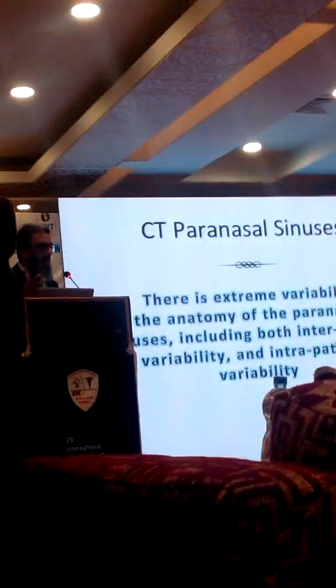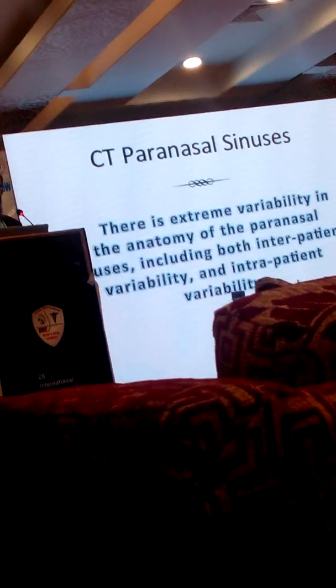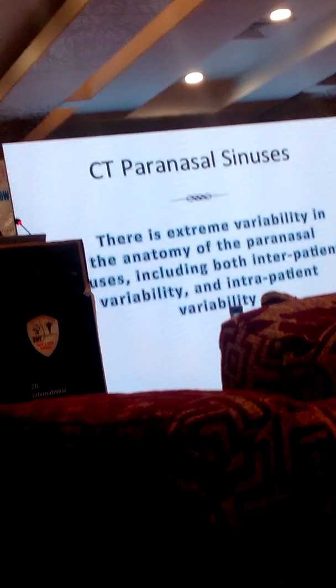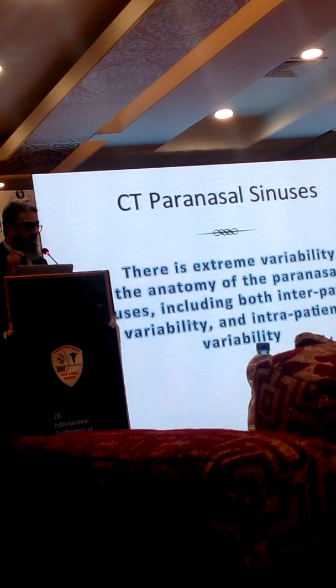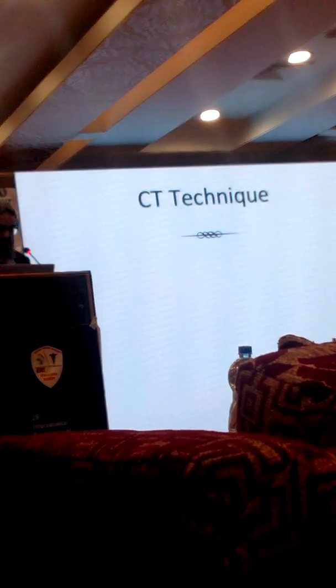One thing we should note is that we are human beings, and in endoscopic sinus surgery we are operating on paired sinuses. No two sides of a single individual have the same anatomy, what to talk of different individuals. Every individual has a different anatomy, every sinus has a different anatomy. So we have to read each and every CT scan before embarking on surgery, right?